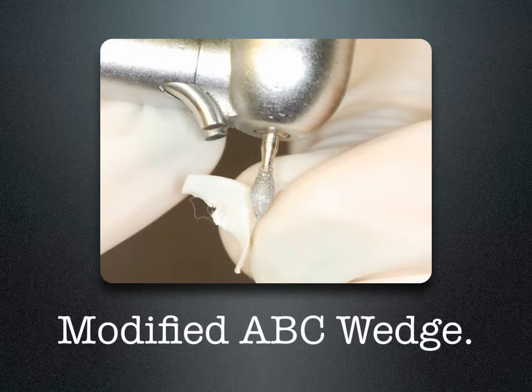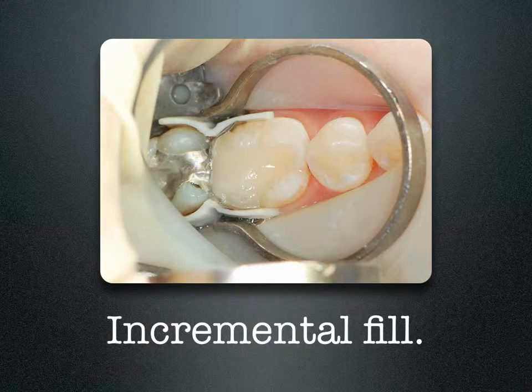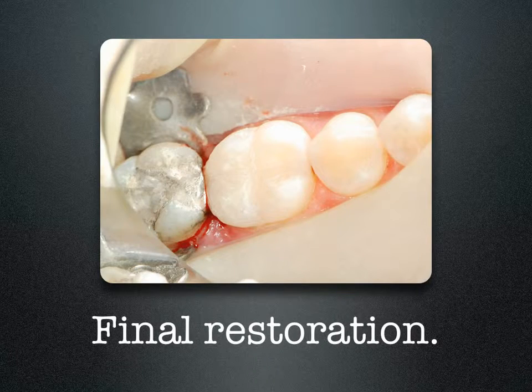I took my stereolithograph prototype, modified the wing area to accommodate the rubber dam clamp and broaden the contact area. By placing them on the buccal and lingual, just like the cement, I was able to seal off and secure the gingival floor, yet support the matrix band so when I placed my separating ring, it didn't crush the matrix band into the box. Using small incremental fills of 2 millimeters with light cure for about 20 seconds, once cured I removed the separating rings and bands, and we had a nice, broad, anatomic contour.